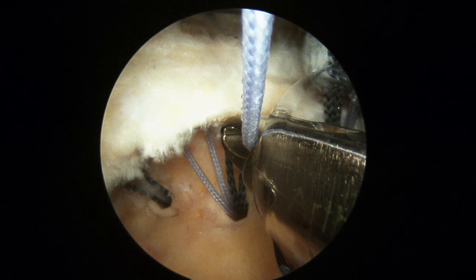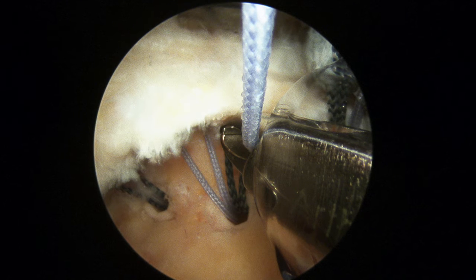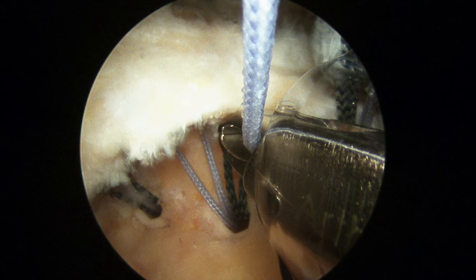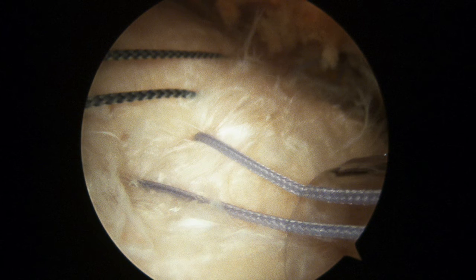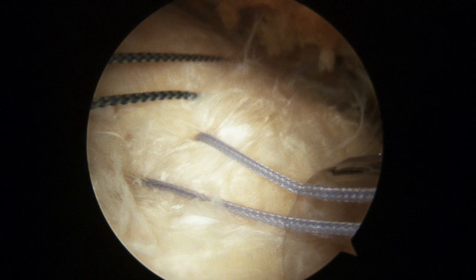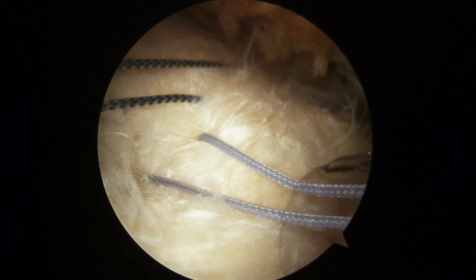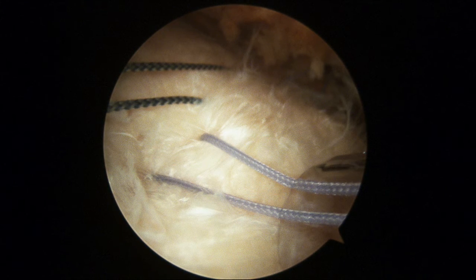We use our instruments to take these sutures and pass them around through the tendon, just like I showed you in the diagram. You can see one of our instruments going in to grab one of the sutures — we've already passed several of them. You can see how they're different colors; these suture anchors have sutures of different colors, which allows us to keep track of which ones we need to tie to each other. Here you can see we've passed that medial row — that first row — and then we're going to tie them down.